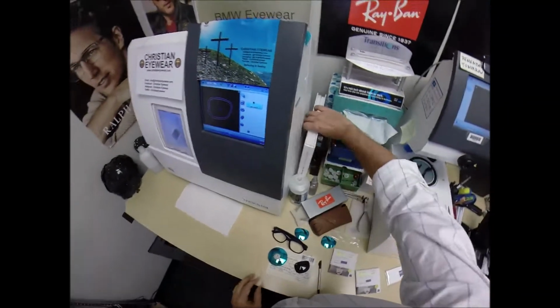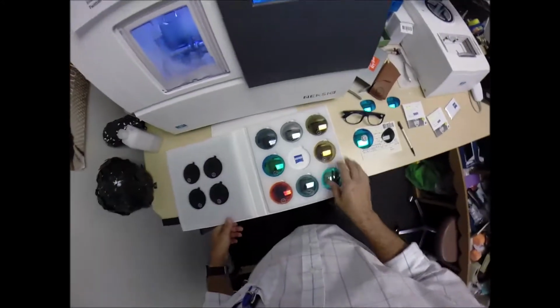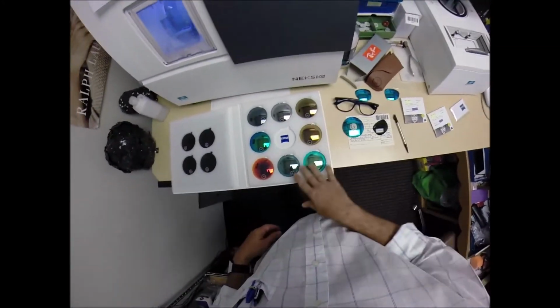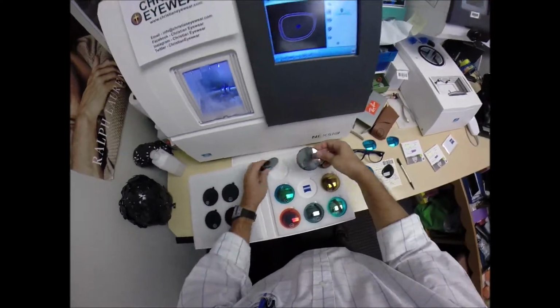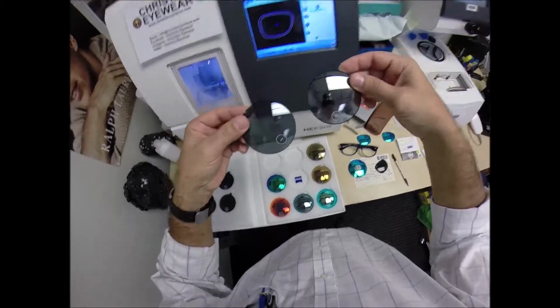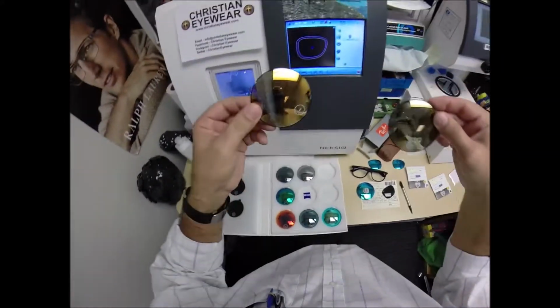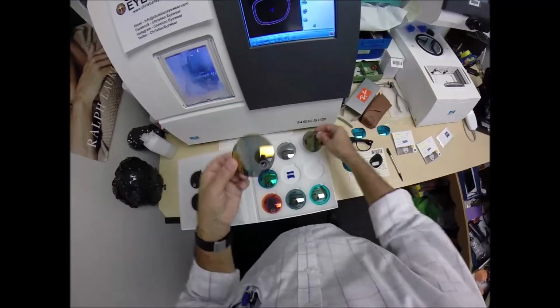Now, these mirror colors you can get in several choices. There are two forms of silver, two forms of gold, two forms of blue. There is a matte silver, which they call white, and a shiny silver, a high luster. There is a matte gold, which they call amber, and a shiny gold.